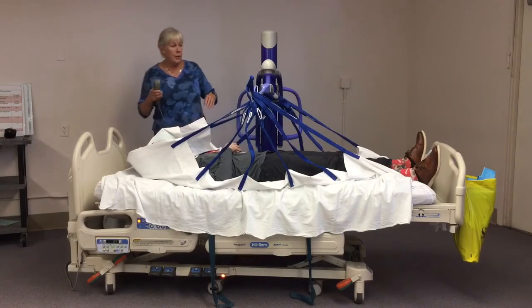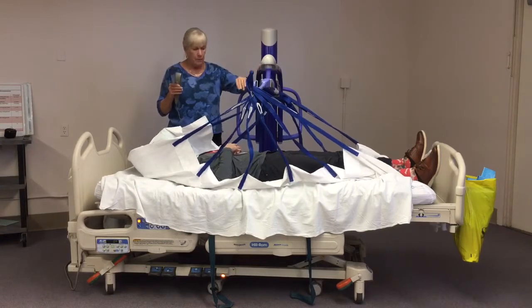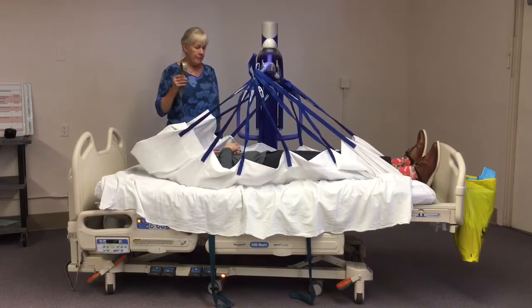Now what I'm going to do is I'm going to lift my patient up on 3, 1, 2, 3. Brakes are off.